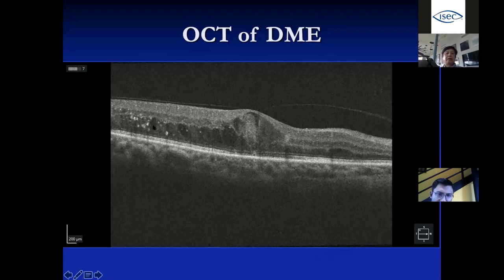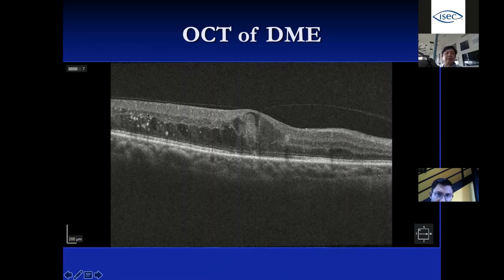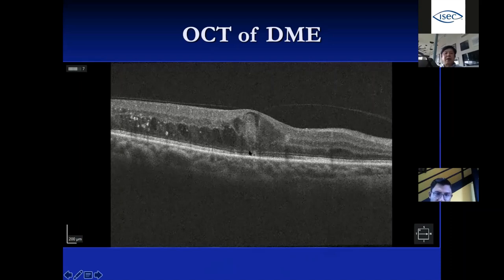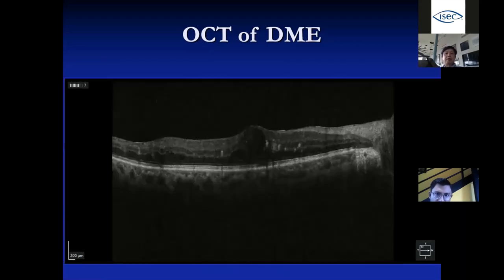In another example, you can see cyst collections of fluid inside — distortion of the inner architecture of different nerve layers. There are also white hyper-reflective dots, thought to represent activated microglial cells present in inflammatory responses. Diabetic macular edema is also an inflammatory response — an injury to the eye. If we can get rid of all this edema, this patient can see reasonably well, because the integrity of the photoreceptors — the outer white lines — is relatively preserved.